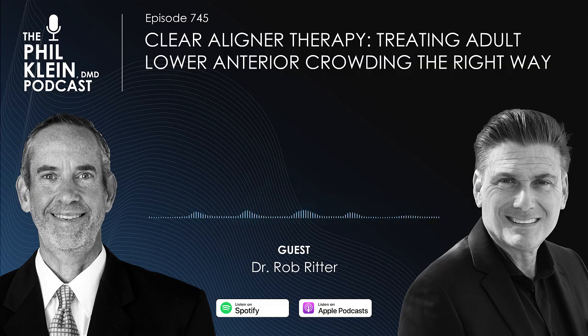position. So now we fast forward to 20 years ago when Invisalign came out. When Invisalign came out, it changed everything for us, didn't it? Because now the GP could very easily take a scan. And of course, we know that Align purchased iTero from Cadent, and we digitized the process from the chair to have those designs made and then aligners delivered, where we could easily move the teeth relatively quickly. Now, it's evolved to the point where you can do more complex cases the more confident you get with this technology. But just to move the teeth and put the teeth back to where they need to be is such a great starting point for your patient. You'll never lose with having the teeth in the right place.